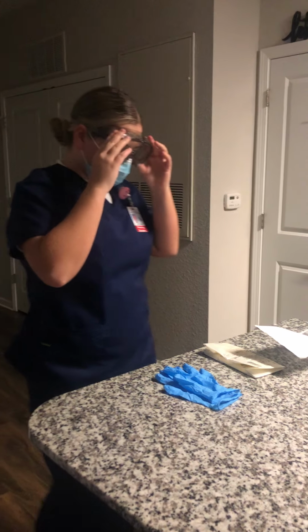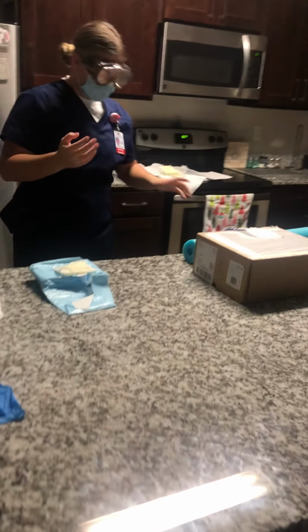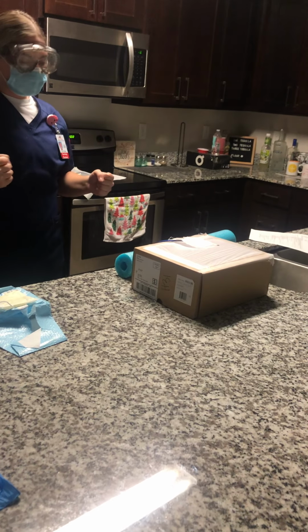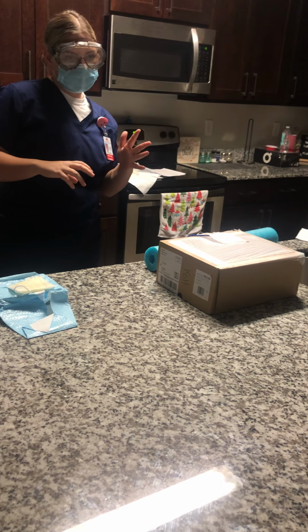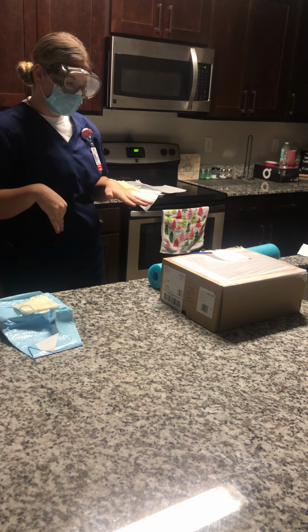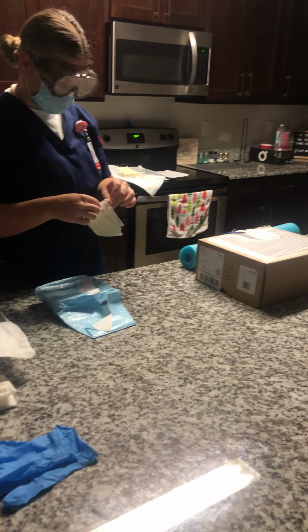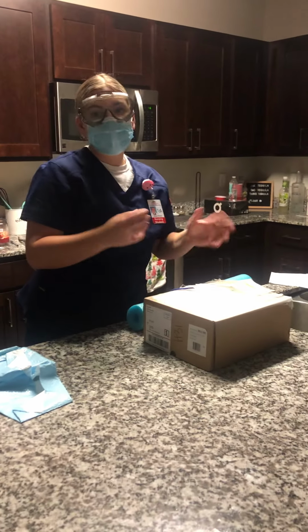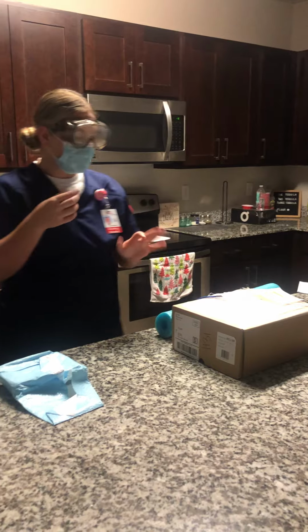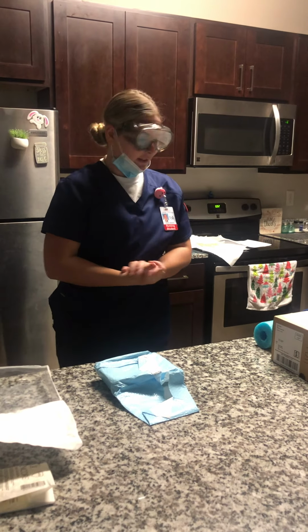So now that I have applied my goggles, I'm going to come over here. And I'm going to raise the bed to a comfortable working height. I'm going to lower the side rail. I'm going to make sure his head is elevated a little bit, make sure he's comfortable. So now I'm going to apply his mask. So now that his mask has been applied, I'm going to move mine lower. They told us we could do that so y'all could hear me when I do this.